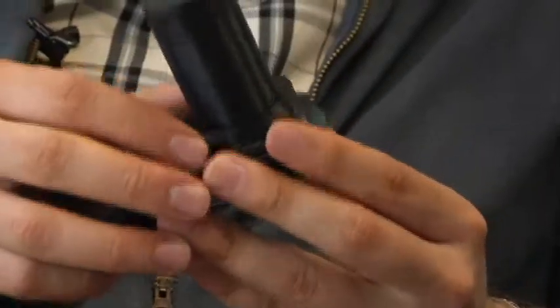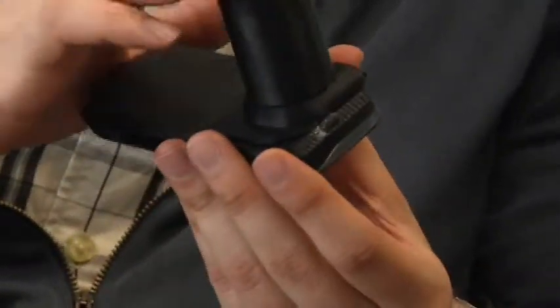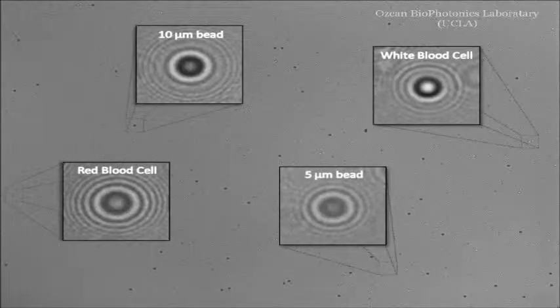So in this device that you see here in my hand, there's a light source that is a light emitting diode, the same thing that we have at the back of our Blackberries. Whenever there is a new email, the thing that blinks is an LED. And you load your specimen from the side using a microscope slide or a microfluidic device, regular slide that you carry your sample. And this light emitting diode here shines. There's no lens in here, and it essentially scatters off the cells that you've inserted. Essentially, this is detecting shadows of specimen.